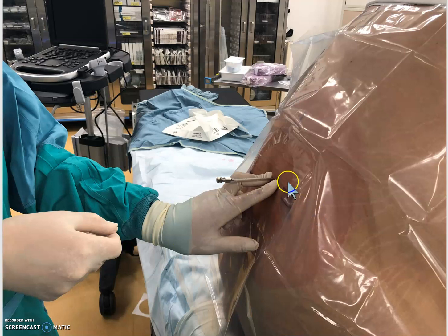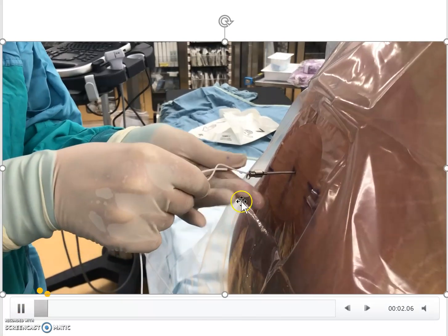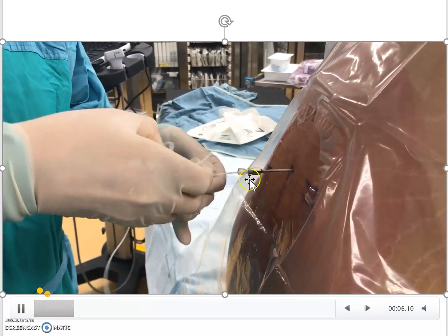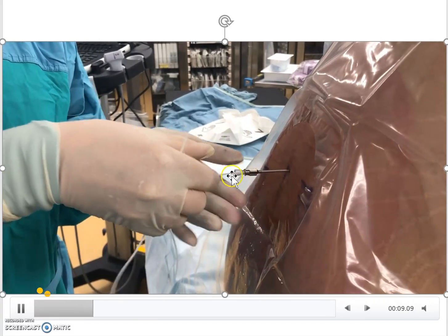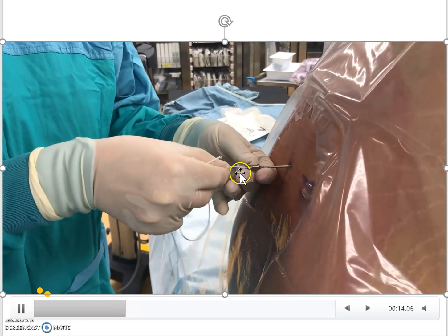You want to try to keep the angle fairly careful so that your drain will thread better. If you go in at too much of a 90-degree angle you're going to find resistance to threading. Once you get to the correct position, remove the stylet from the needle and you should see a rush of CSF. Then start threading that catheter in — note the cone piece acts as a bit of an introducer to stiffen your catheter.